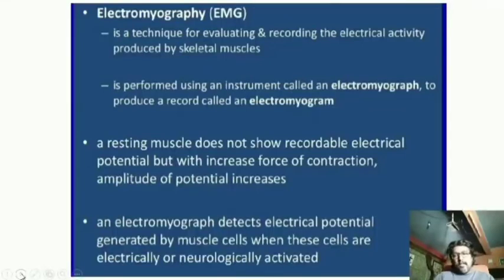We are going to see a recording setup, a biomedical recording setup that can be useful for analyzing the muscle activity. Where can it be useful? It can be useful in plenty of places, especially for sports persons who are undergoing severe activity that is related to these muscles.